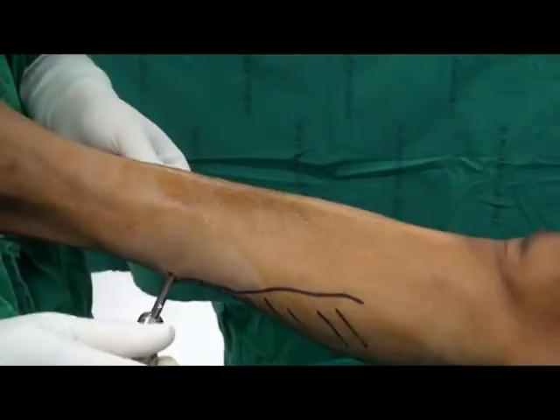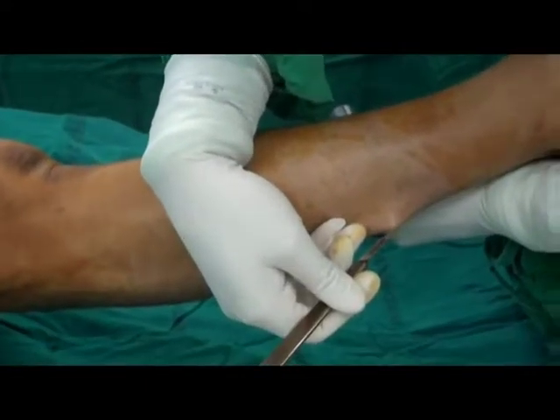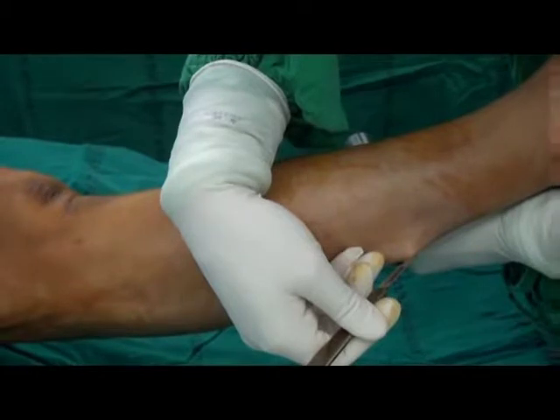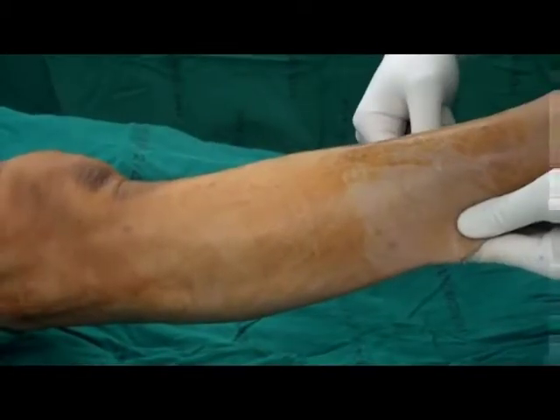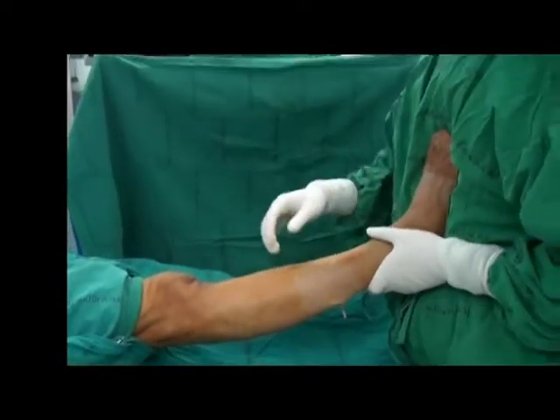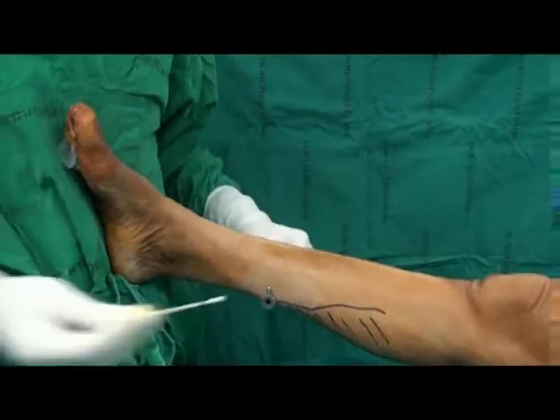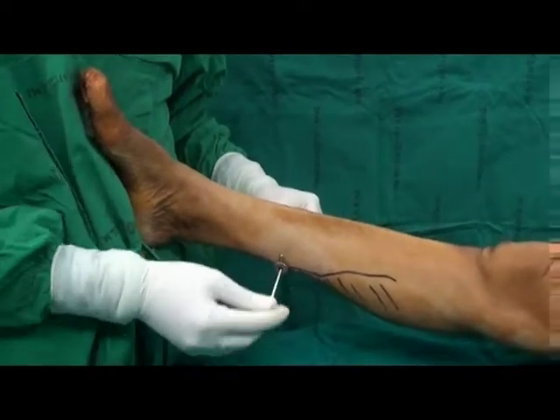A slotted cannula is introduced from the medial portal and exits at the lateral portal. A number 15 scalpel is used to create a 3 mm incision for the lateral portal. Both medial and lateral portals should be in line, and a blunt Q-tip is used to clean the blood.